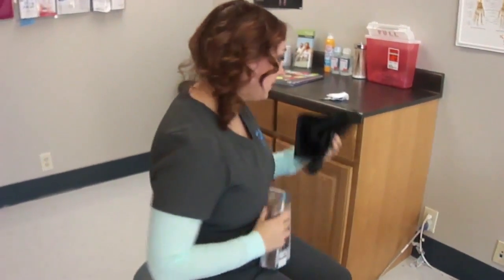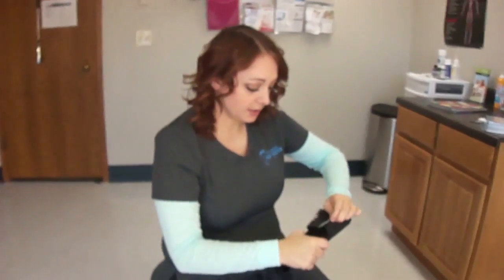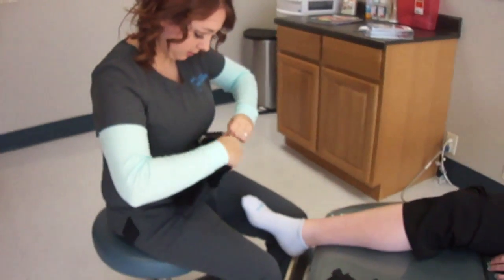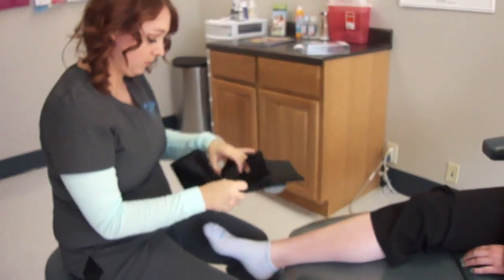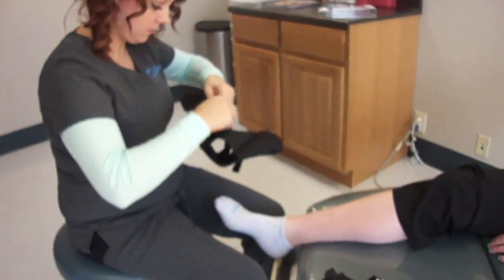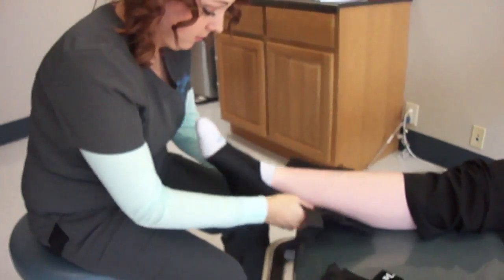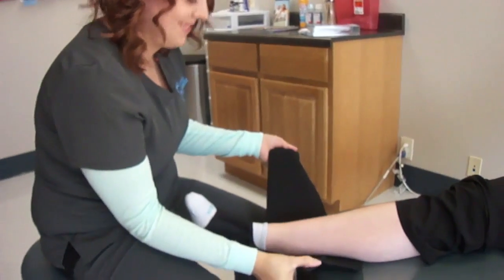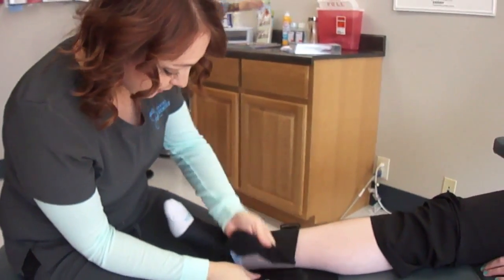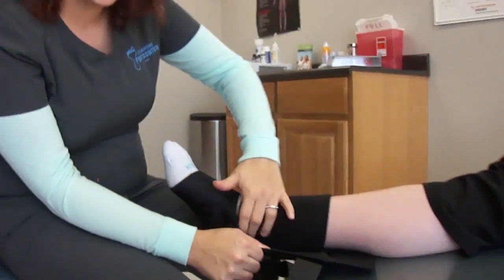It comes with two pieces. This first piece you're going to slip on kind of like a sock. And then this piece here goes around the ankle just to kind of protect that bone there.